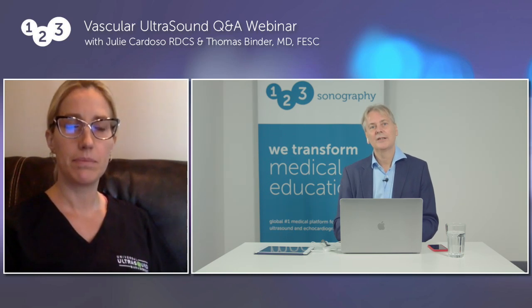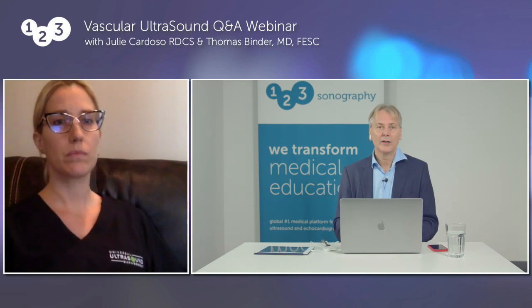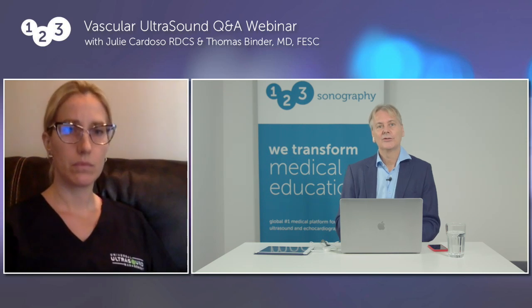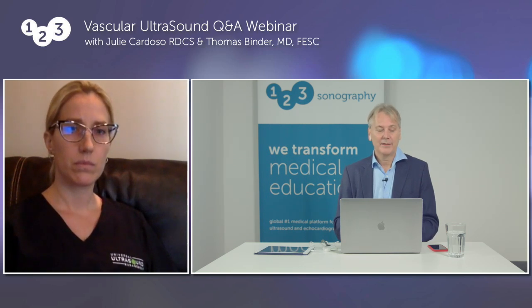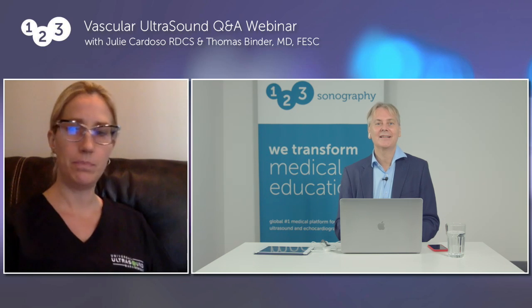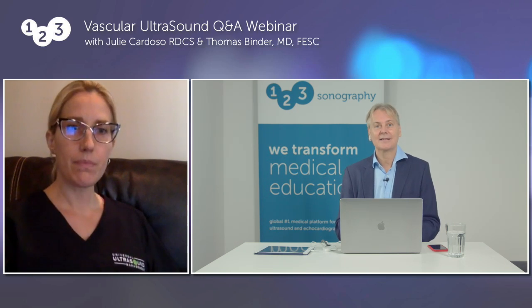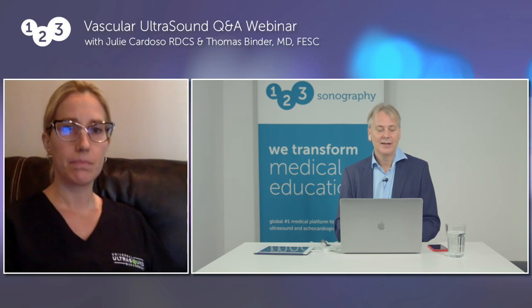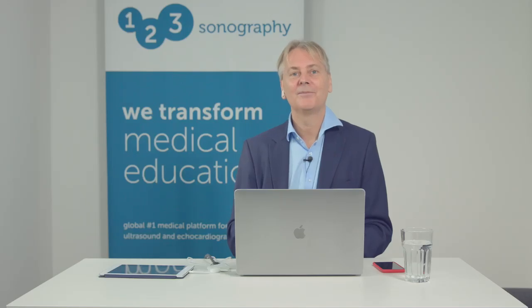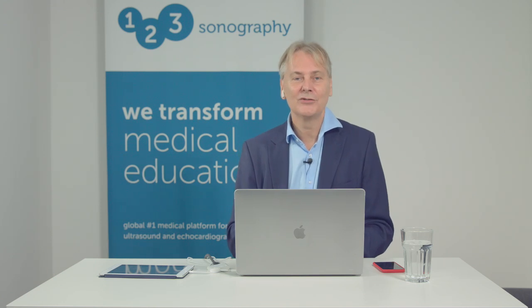This is interesting because I do see that the use of ultrasound varies greatly depending on where you are. There are many centers who do not use it yet, and maybe also a lack of expertise in using ultrasound. I come from the cardiology arena and must say that it's probably underutilized for vascular access to perform heart catheterization. So I guess we still have a lot to learn from the vascular experts, because it's a neat way, and you obviously have a higher success rate if you use ultrasound.